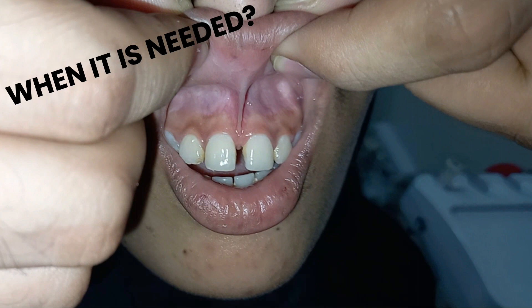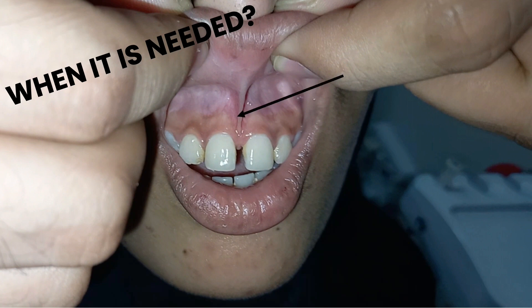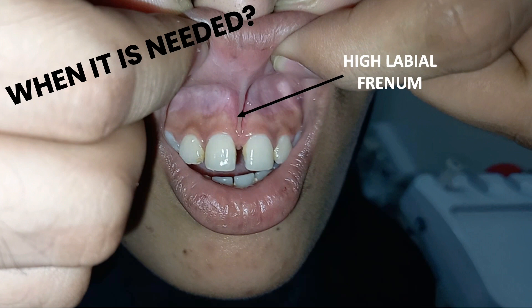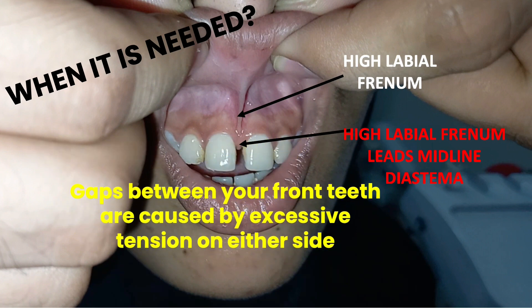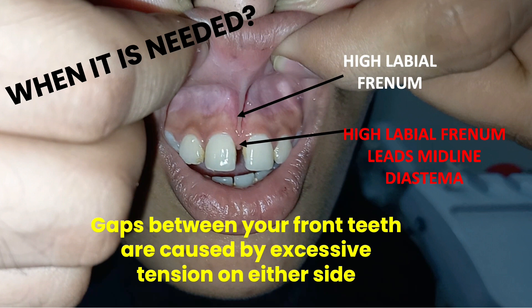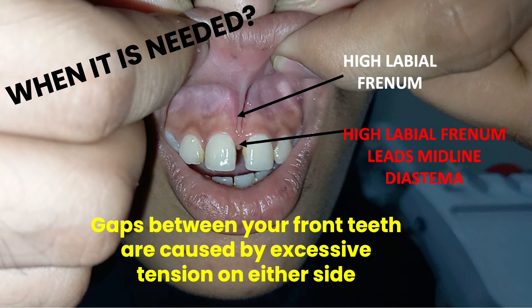Why do we need to do frenectomy? Yes, we need frenectomy because if we do not remove a high frenum it will lead to many dental problems. As you can see, due to a high labial frenum there is a gap in the central incisors — this is called midline diastema. There is a gap between the front teeth caused by excessive tension on either side due to the connective tissue of the high labial frenum, so we have to relieve this tension through frenectomy, otherwise the gap will increase over time.